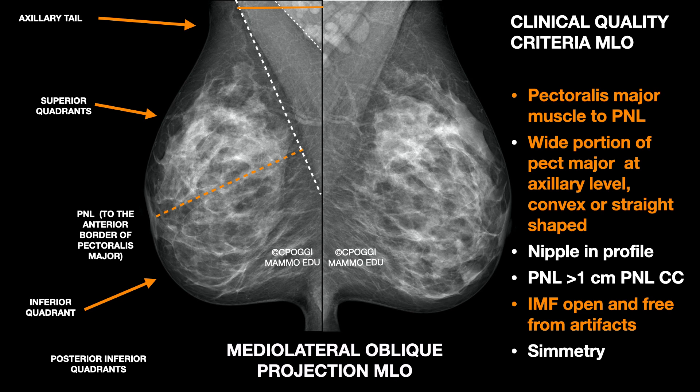Very important is also the documentation of the IMF, open and free of artefacts. Actually, it is not the IMF in itself that is important — the probability to find lesions in this location is very low. It is much higher in the posterior inferior quadrant, just above and in front of the IMF, and you can see it only when the IMF is present, and you don't see it on the CC projection.